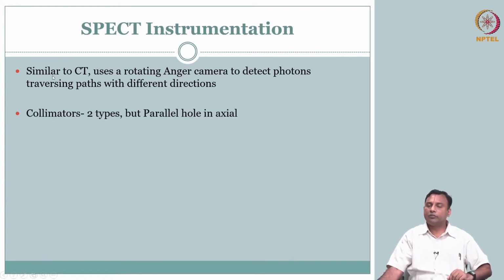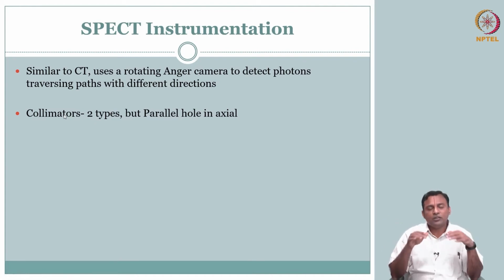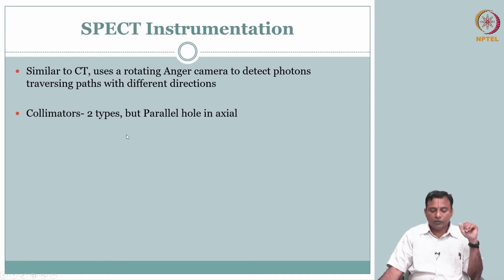Here, because of the way it is done, you have your collimators. Of course, we will think about the parallel hole collimator, but you could also have the diverging and the other types that we talked about. So, you can think about having a fan beam in some sense. We will talk with parallel hole so that it is straightforward relative to what we covered in our X-ray CT, at least the introductory material before we compensated it for fan beam. Okay, so we will do parallel hole.